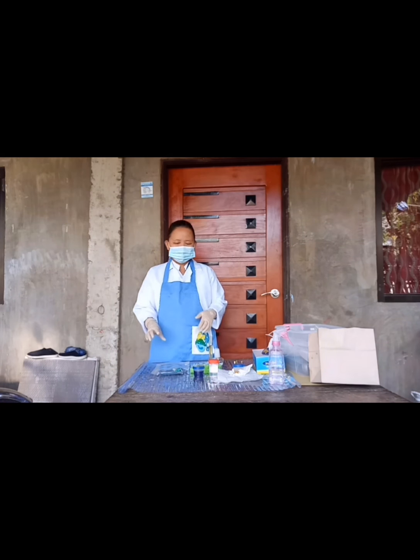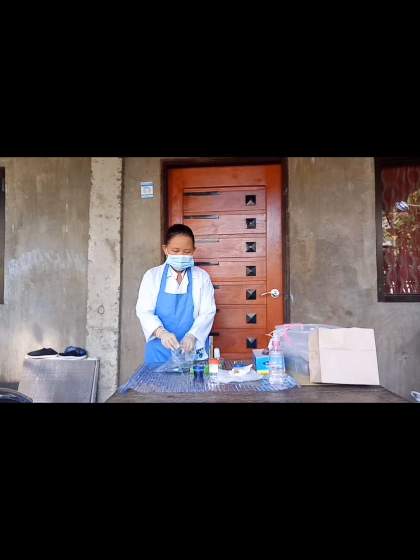Now we are going to add a few drops of acetic acid to the solution.